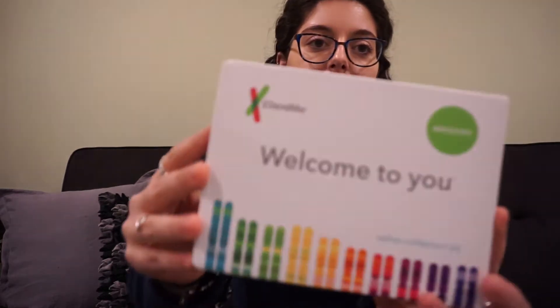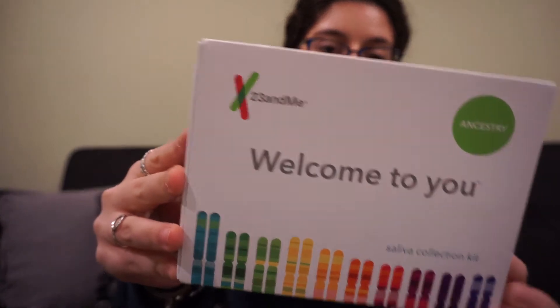So this is the box that it comes in. On the back it has a three-step process which I'm going to be completing throughout this video. The first step is to go and register your kit — you just have to go onto their website. I already did that part. All you really have to do is fill out your email, your personal information, and then verify your email.